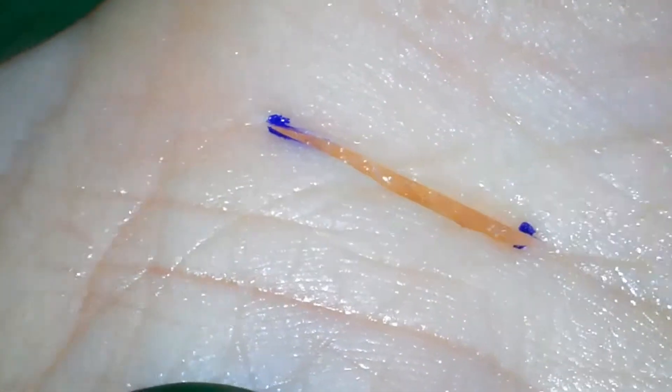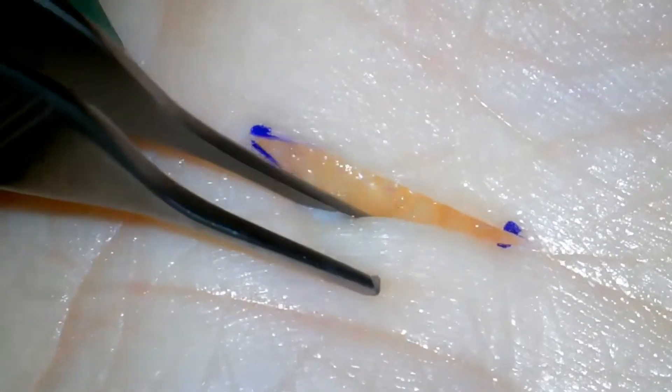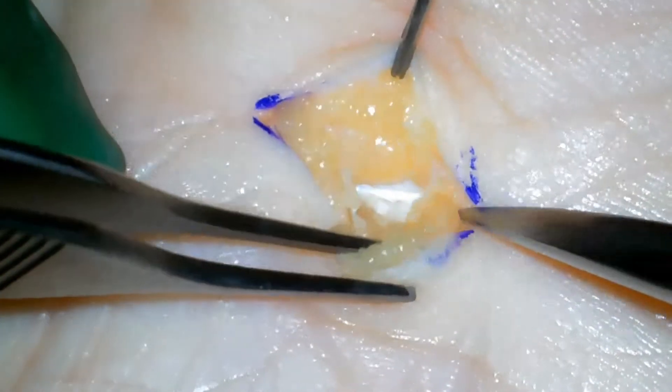The first layer encountered is the subcutaneous fat. The subcutaneous fat is spread bluntly with dissection.